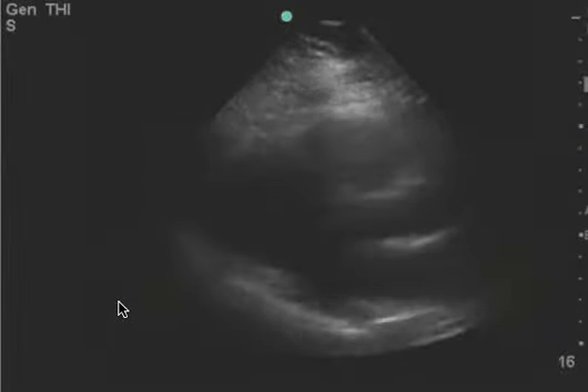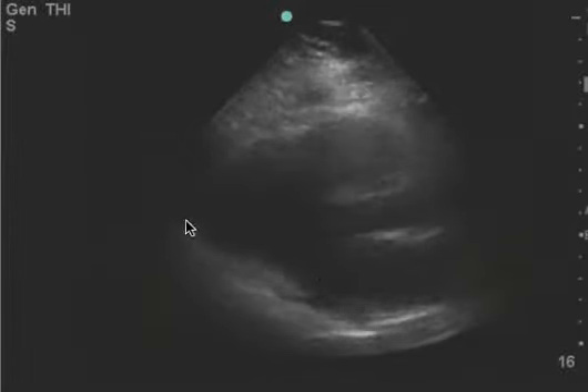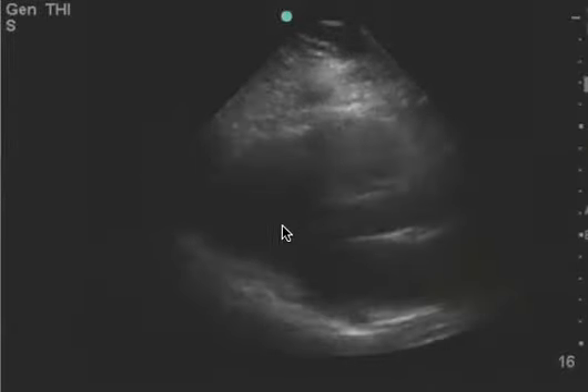I don't think you should tilt the probe in any way or change your rib space, because I can see the anatomy pretty well. It just looks a little grainy to me here on the pericardial wall.